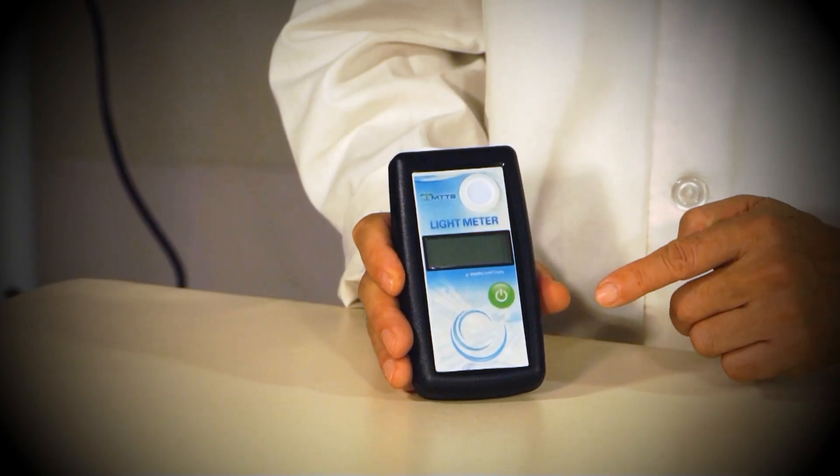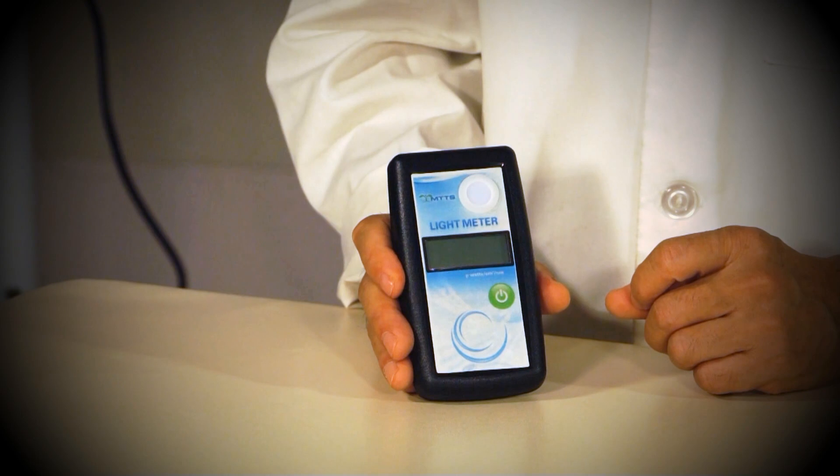To operate the light meter, gently touch the green power symbol with your finger.